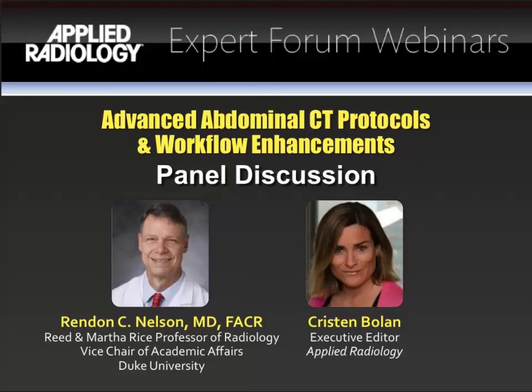If, however, you're imaging in the arterial phase, either alone or in combination with the venous phase, giving a saline chaser at its optimum will give you about an additional 10 Hounsfield units of enhancement in the aorta. So it's not going to give you a lot more enhancement, but it will give you a little bit more. One of the strategies is actually to go to a lower iodine dose with a saline chaser to give you the same amount of enhancement. That's also another strategy.